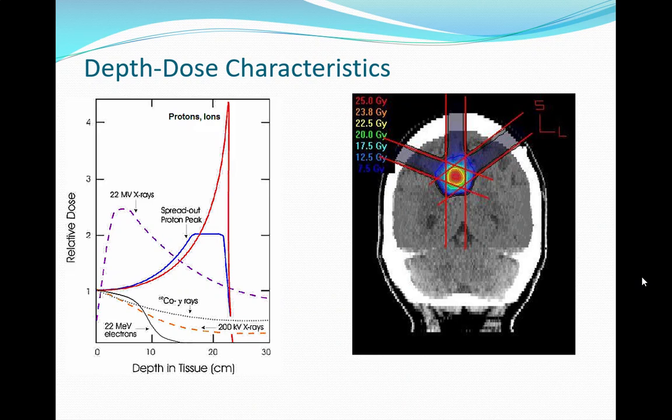But in all cases, really, we're looking at the tumors. You got these exponential drop-offs. With electrons, you'll see it's actually really high and then kind of drops off. Right? So they've got a much smaller depth they can go towards. Not really useful for further in stuff, but if you got things near the surface, that's actually quite good. Again, think of these in terms of, we're not saying one is the right technique, another is the wrong technique. It's the right technique for the right area. Right? That's actually, we're trying to get tools.